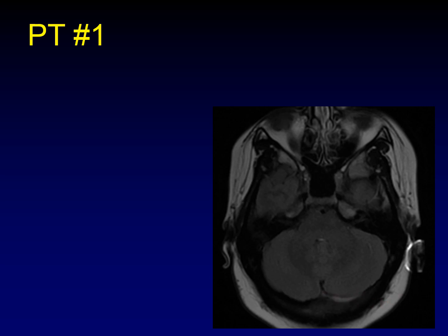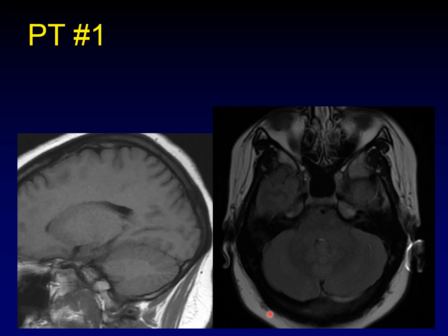Let's double check that on T1 weighted sequences. I love looking at T1 weighted sequences for flow void in the transverse sinuses. It's perpendicular to the plane of imaging, so it's really sensitive for flow void. And there is a lack of flow void in that transverse sinus right where we're seeing the abnormal FLAIR signal.